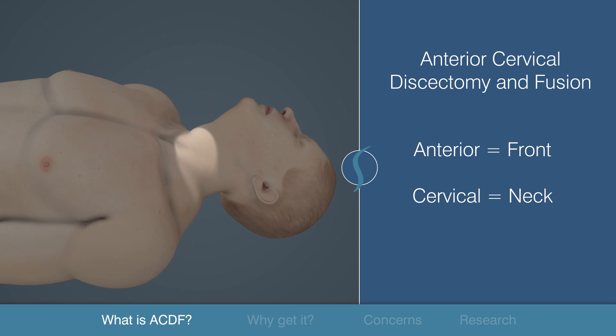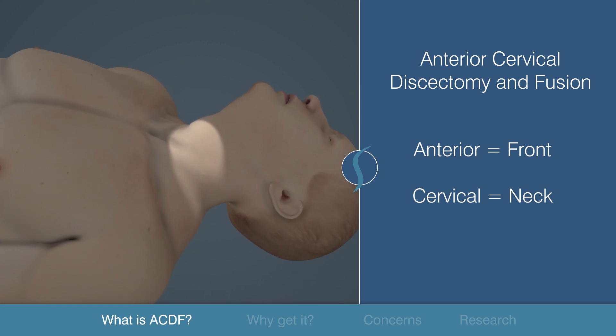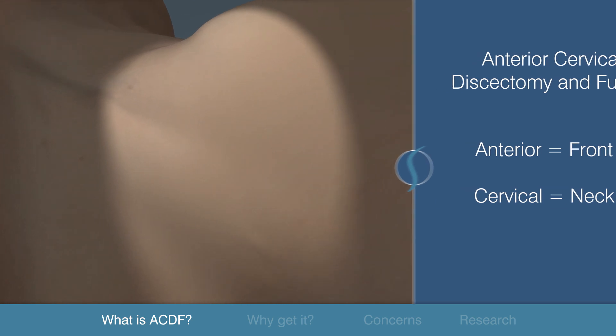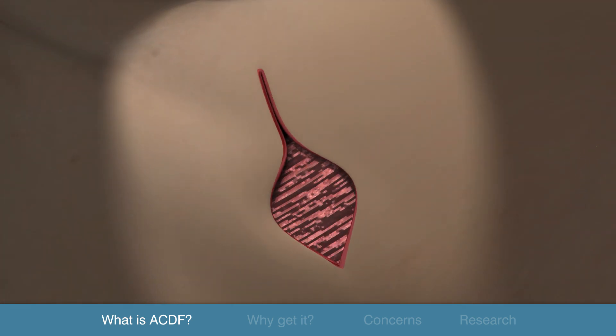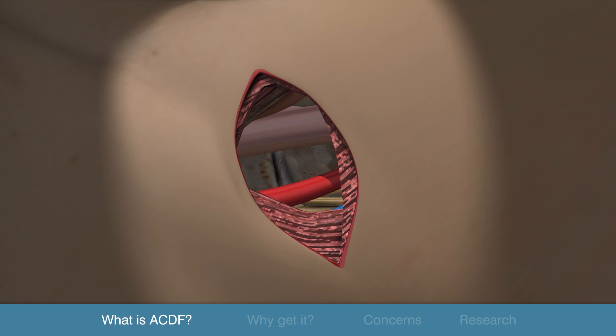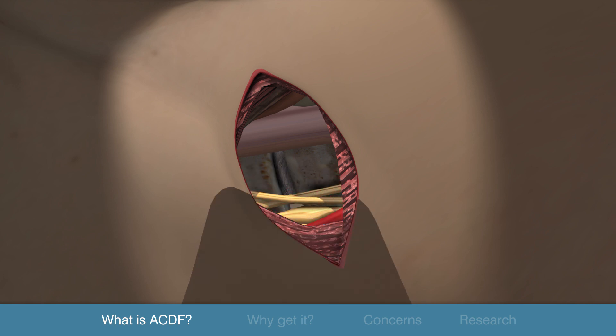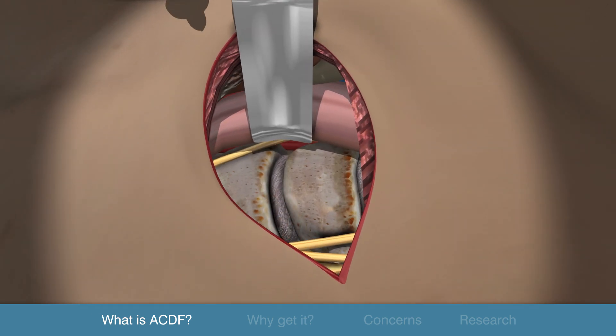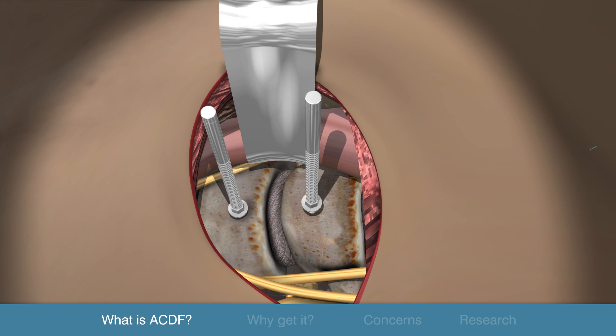The surgeon makes an incision in the front, or anterior, neck or cervical area. The incision is not just skin deep. Care is taken to safely dissect between the different muscle planes and avoid damage to other important structures. The esophagus, trachea, and major arteries and veins are carefully retracted, allowing the surgeon to visualize the targeted spine area.